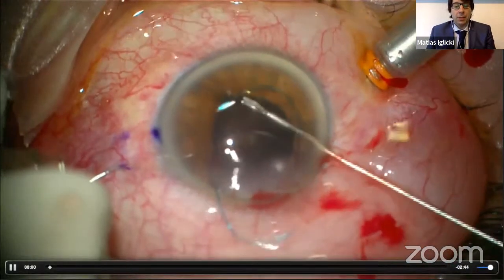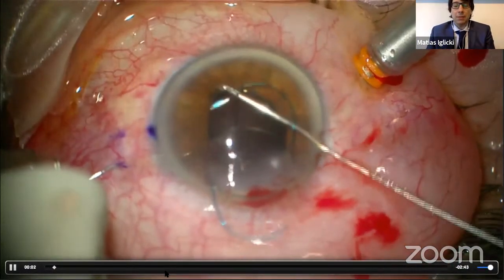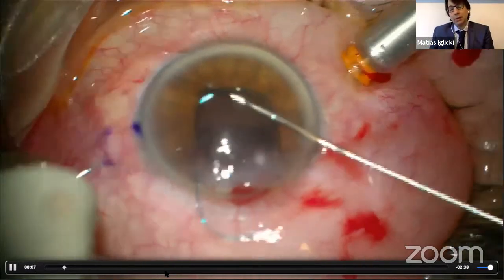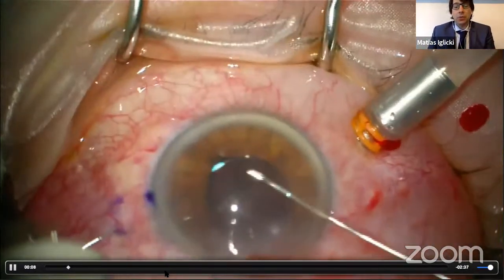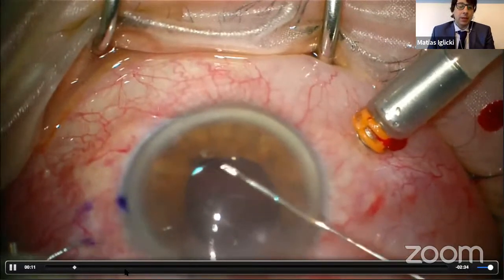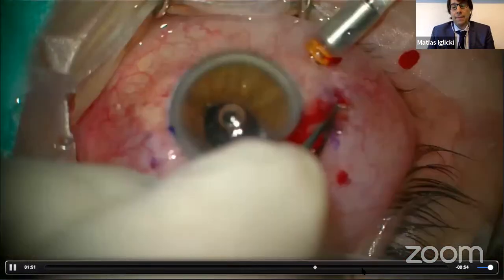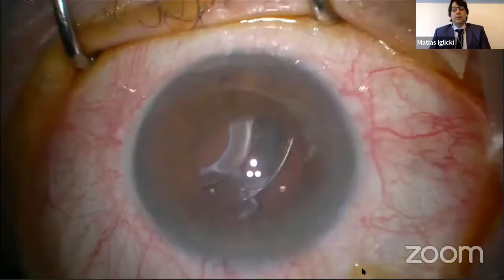So again, I don't want to bother with the same thing, but it's very easy to insert it. And this is the key. And when we are pulling out, there is no way for the haptic to slip away. So we are going to go a little bit farther. And then as you might see this.